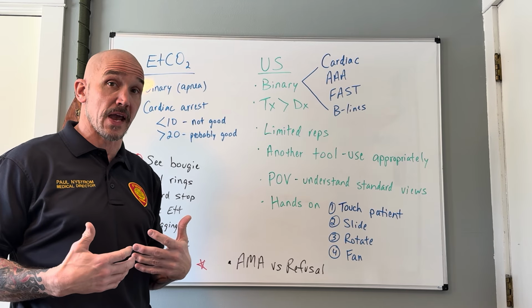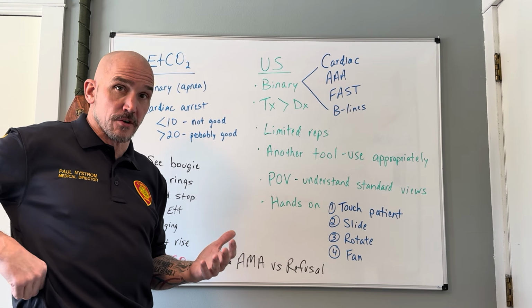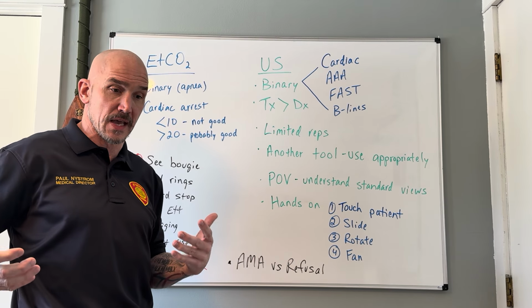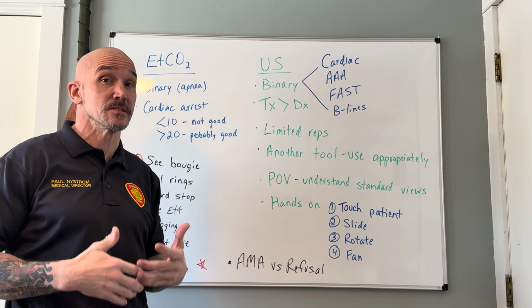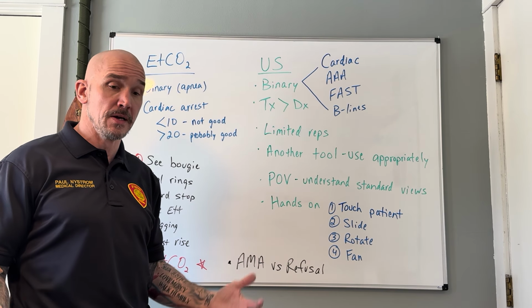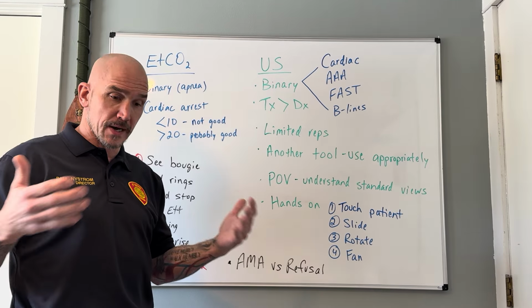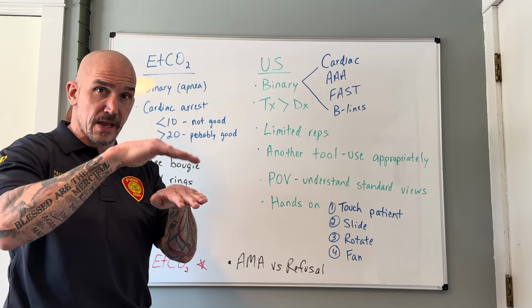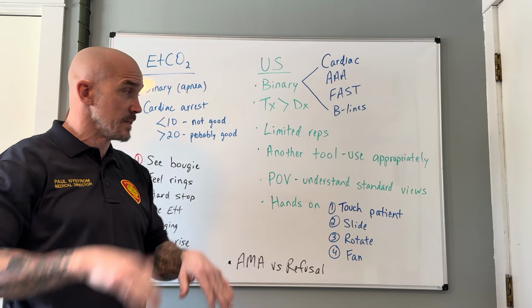But if they already told you they have ascites, you can see in real time what a patient that has a positive FAST exam looks like, because ascites and blood in the abdomen are going to look similar. Ascites is typically a much larger volume than a FAST exam, but specifically looking at Morrison's pouch, you would see what it looks like to have fluid between the liver and the kidney.